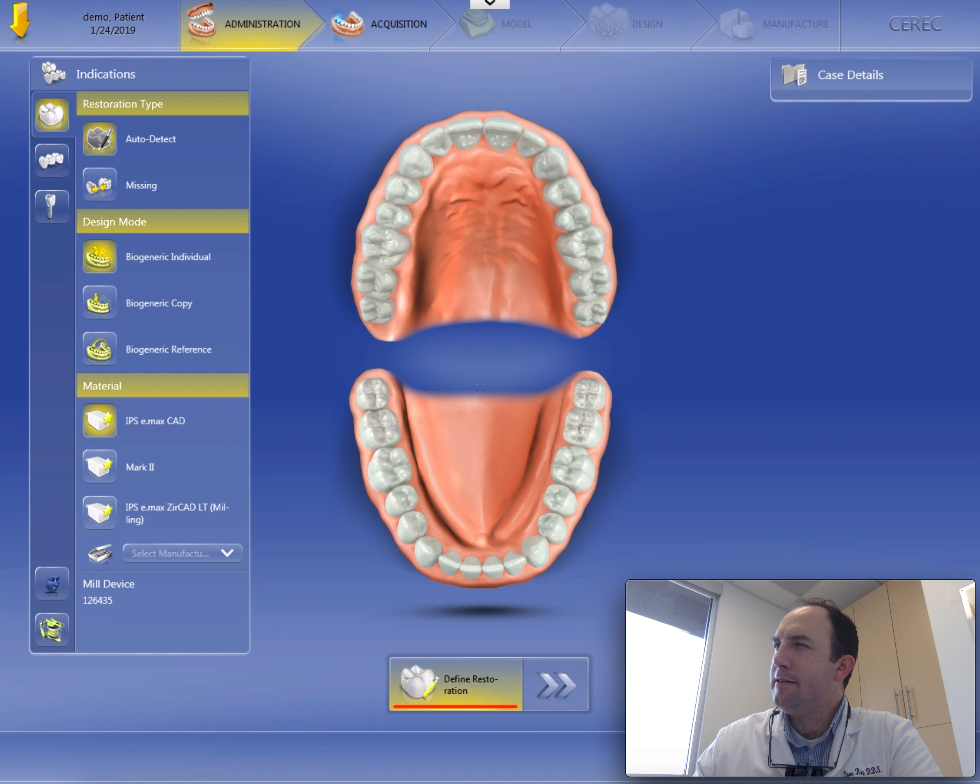Hello, welcome back. Let's go ahead and set this case up. We have two anterior implant crowns that we're working on, number eight and number nine.